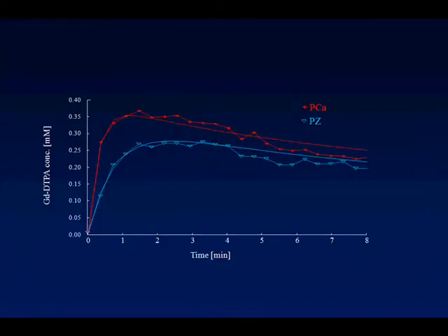And because we can examine the prostate gland with contrast over and over repeatedly in such a short time frame, you can actually do pharmacokinetic curves, which is what we've done with some patients on the 1.5 Tesla. And we've shown that prostate cancer basically enhances earlier and enhances more than normal peripheral zone.